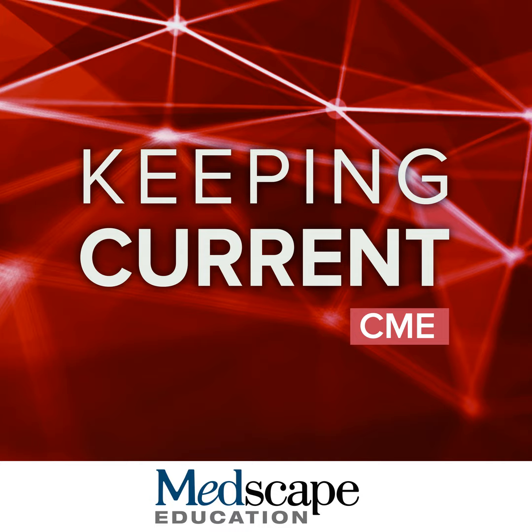They are potentially going to get many doses of gadolinium. And so we try to limit how much contrast they get. There are different ways to achieve that goal. The first approach, and we kind of touched on it earlier, would be to do MRI without contrast. And that's what is done sometimes. The concern is that potentially there are some new plaques that you could only detect after contrast that you wouldn't detect without contrast. So that's a consideration when choosing this approach.